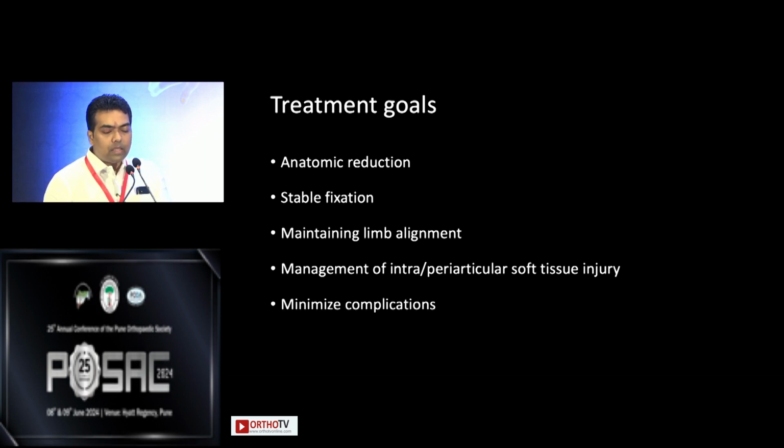One thing is very important which we need to remember: the tibial plateau surface is a surface, it's not a line. Therefore, whoever attempts to elevate these fractures under fluoroscopy has to take care that the whole of the fracture is elevated and compressed well, sandwiched between the intact lateral and medial surfaces. Because if the fracture remains mal-reduced, the chances of it getting depressed over a period of time are higher.